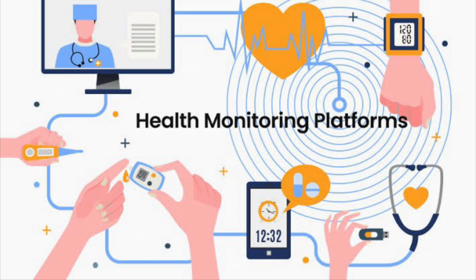Second is patient experience and engagement. Whether the patients feel that they are being looked after better, they become an e-patient. E-patient means an empowered patient, or an engaged patient. They feel that they are engaged in their own care. And third is financial reimbursement. There are two things that should be looked into: whether these are eligible for financial reimbursement by insurance agencies, and whether the institution benefits financially by implementing this, maybe by cutting down costs on one side, or by adding revenue on the other side.